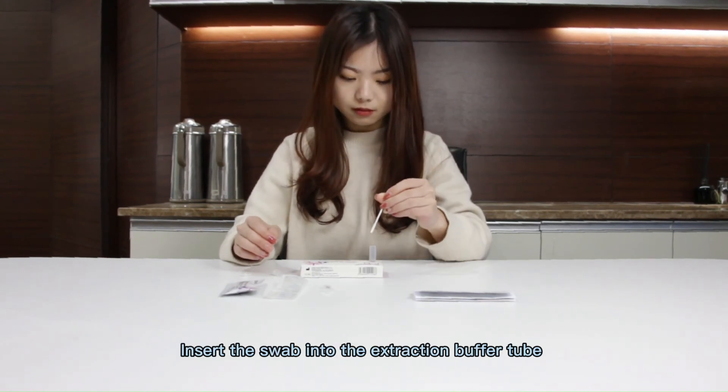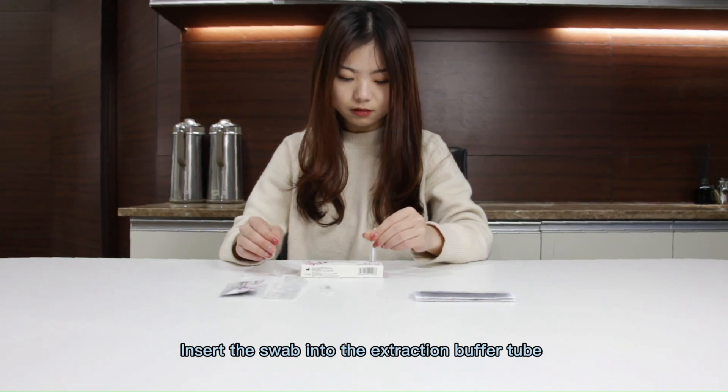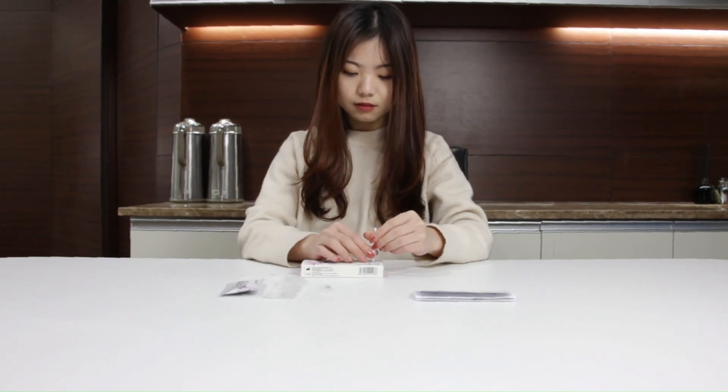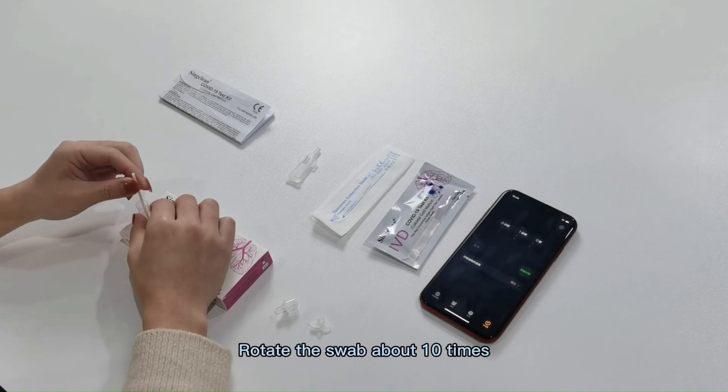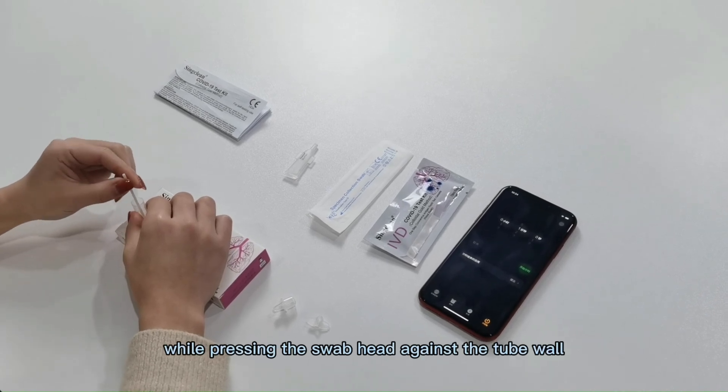Rotate 5 times. Insert the swab into the tube.